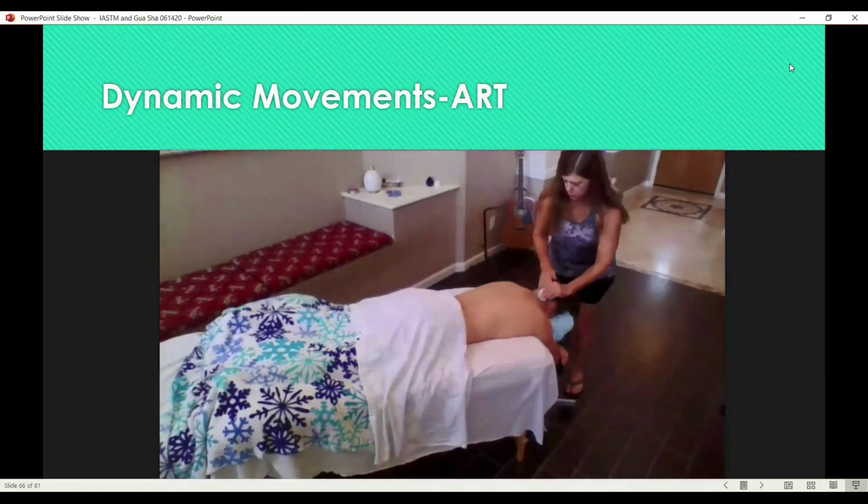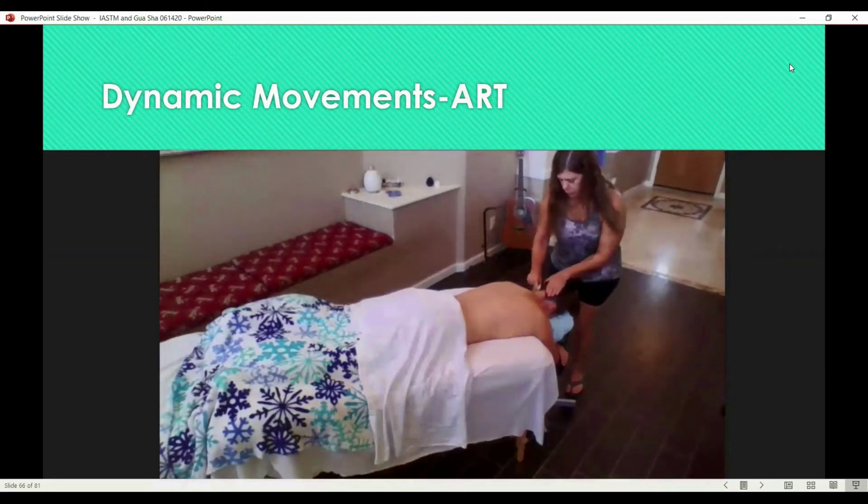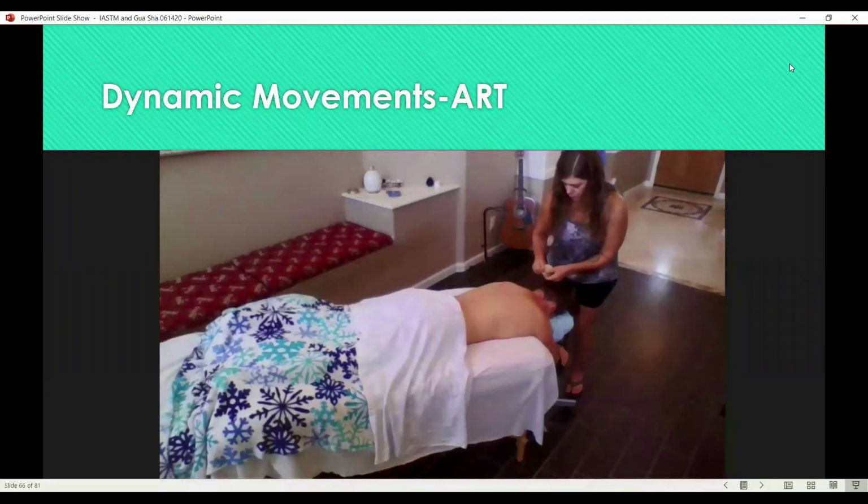Here we're just assessing some of the fascia in the cervical region and then coming back around and doing some more detailed work. Getting right up underneath the occipital bone here. Usually from mid-neck, you work up into the hairline and then from mid-neck down toward the upper traps. So we're doing the upper cervicals that direction.